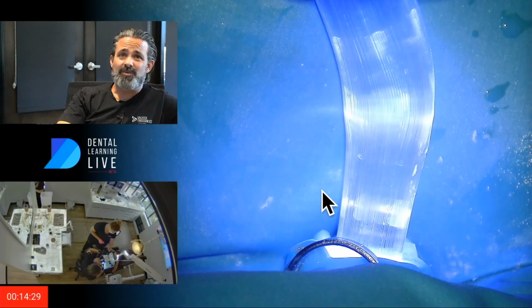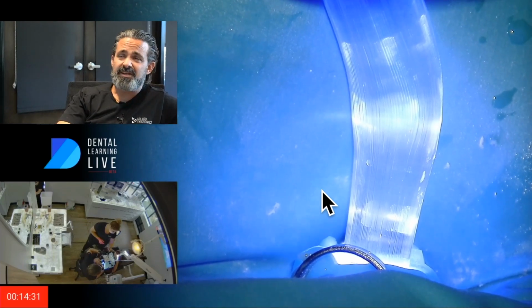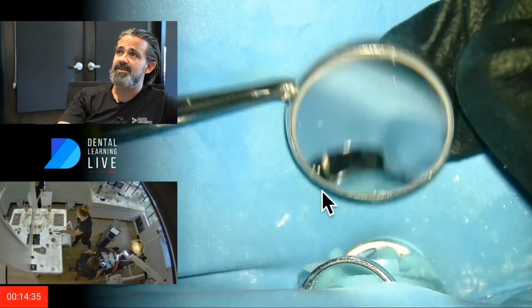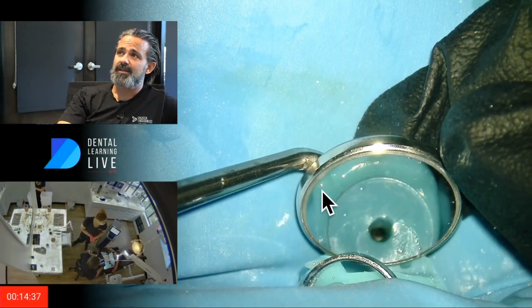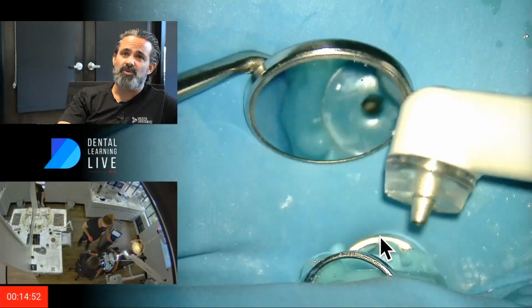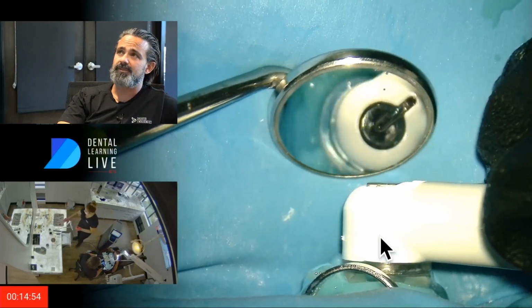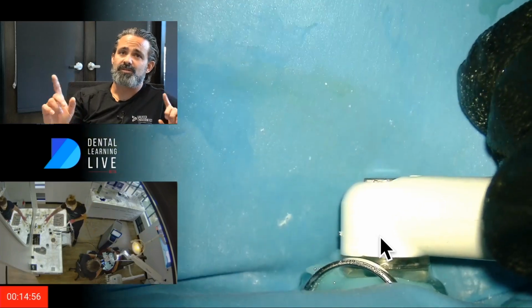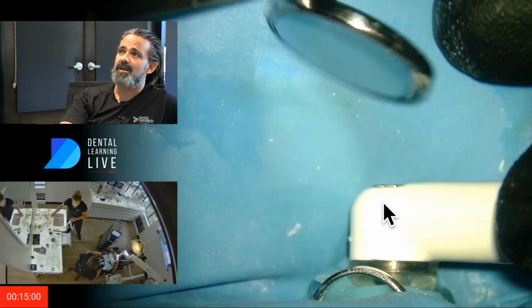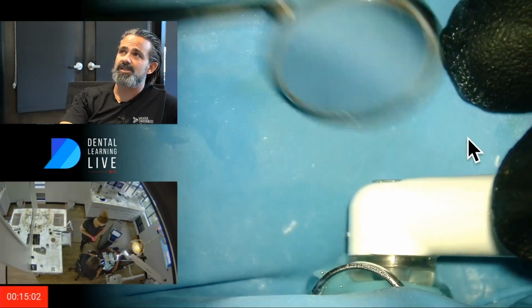So really minimal instrumentation, a little bit finicky on the Sound Seal, and I've just become that guy that's going to spend the time up front. And then I want to just see, when I look in it, that I can see both orifices in that, and that's what I could see. So just the buccal, lingual, facial, palatal, whatever your terminology is, and that's it. And then we let her rock. We just let it flow.